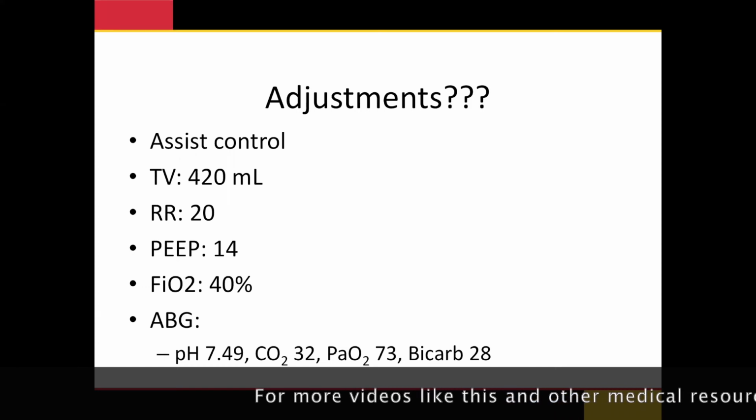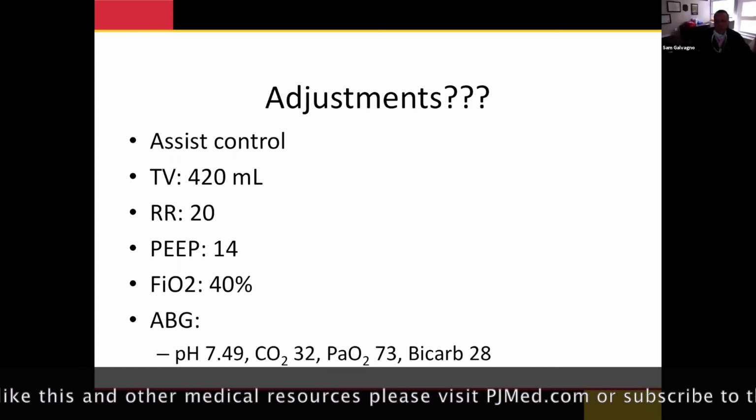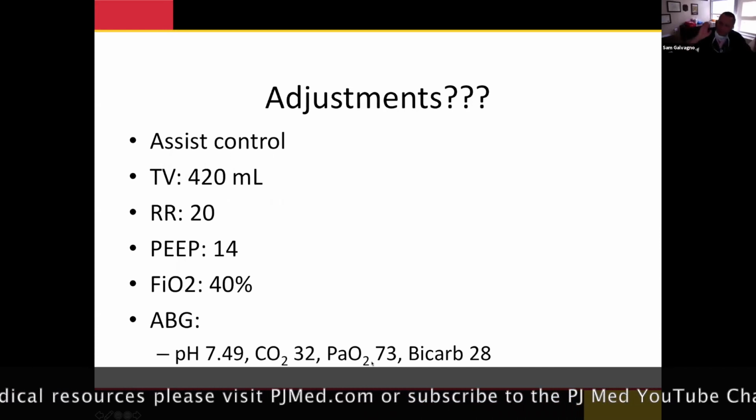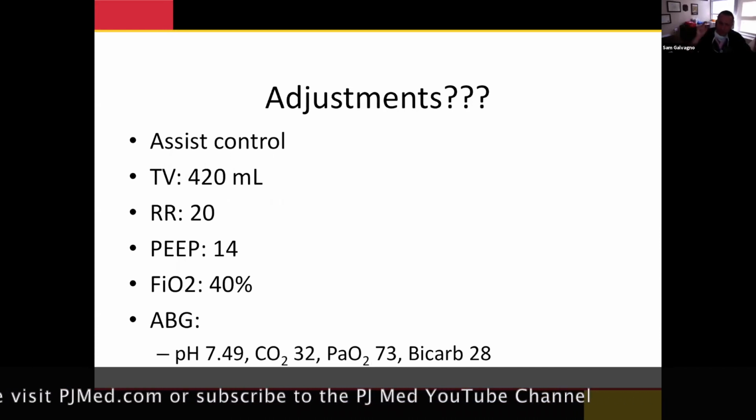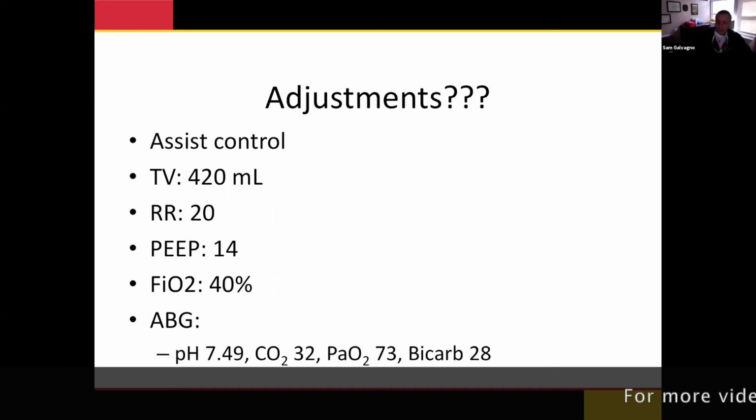Yeah, it's starting to be a little low. So this again correlates to your SpO2, which is your pulse ox. The PaO2 is your arterial oxygen level. And in this case, it is low, but it's not catastrophic.